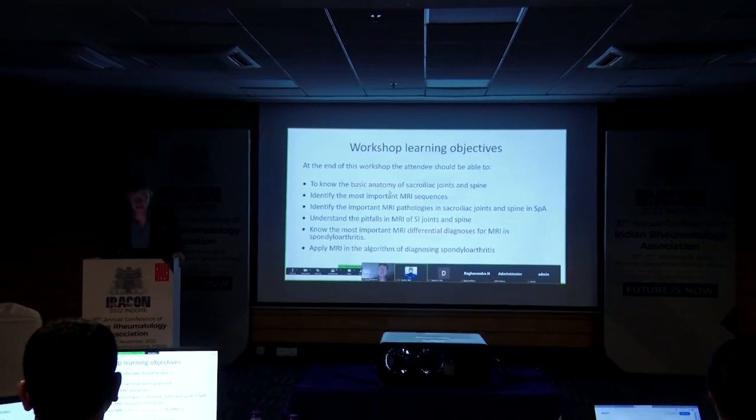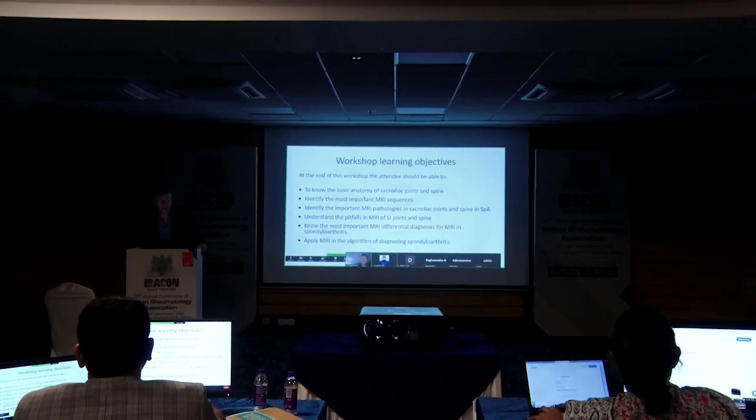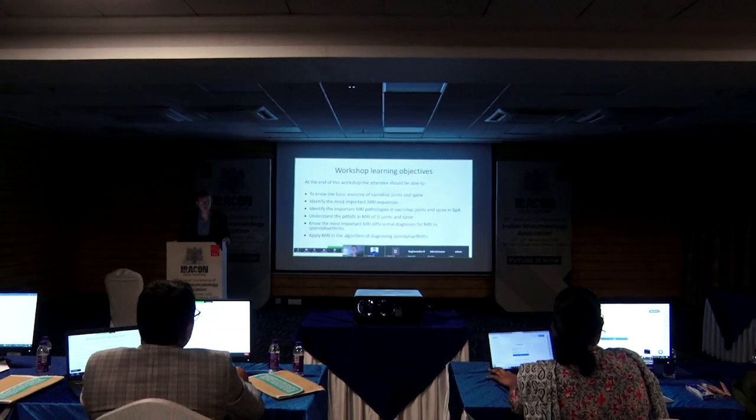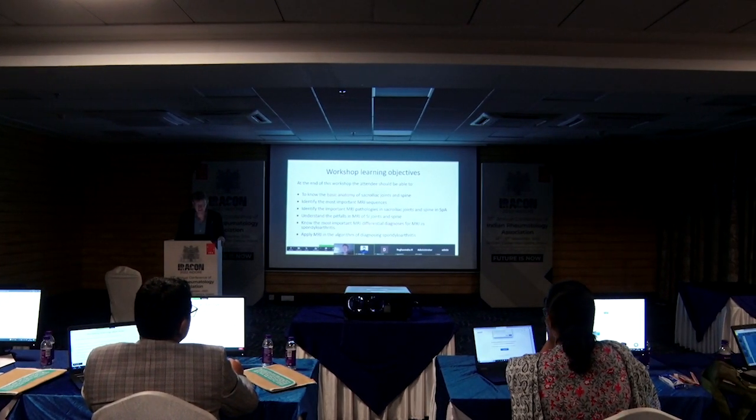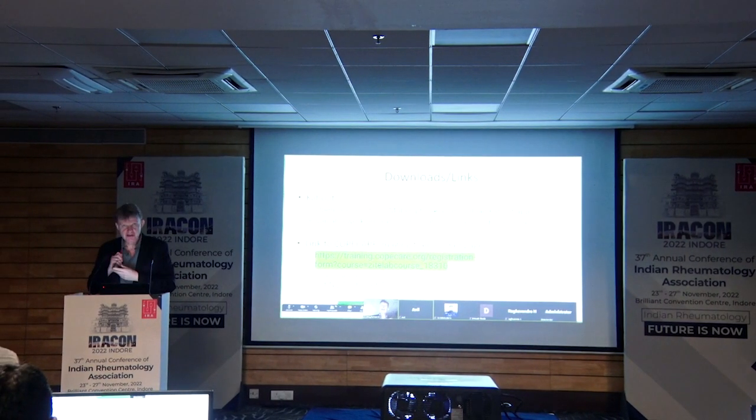joints, both the sacroiliac joints and later today the spine. Then what sequences do we use, how do we obtain our images in their offices. And that's where you can find on your laptop.